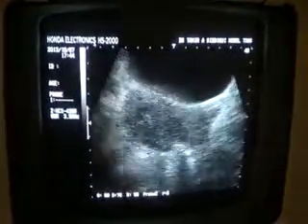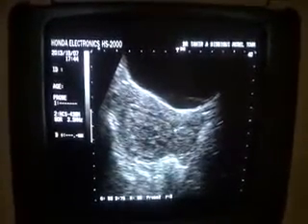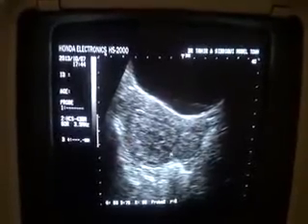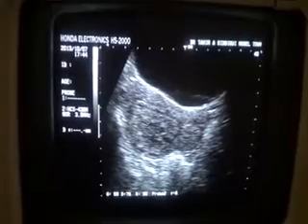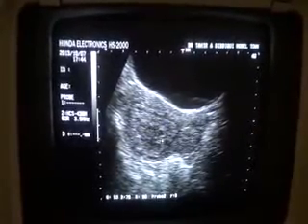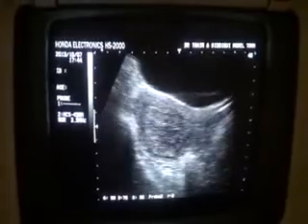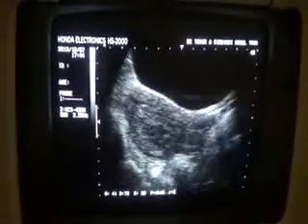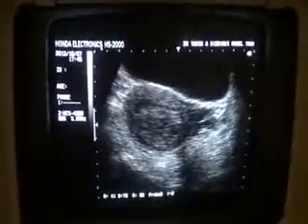Now this is a still image — let us study on real time. This is the longitudinal section. Here you are seeing the urinary bladder, the anterior lip of cervix, posterior lip of cervix. Here you see the endometrial canal adjacent to the posterior wall. Again, well-demarcated echogenic area with numerous tiny cystic areas within it, and the anterior myometrium is clear. So until proven otherwise, this is a case of complete molar pregnancy.